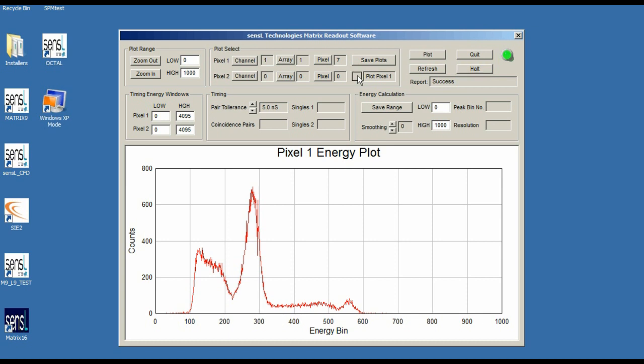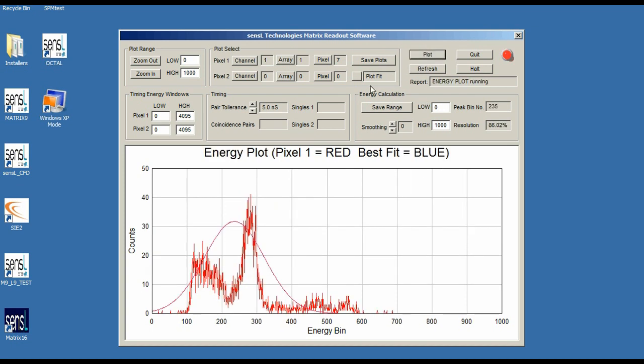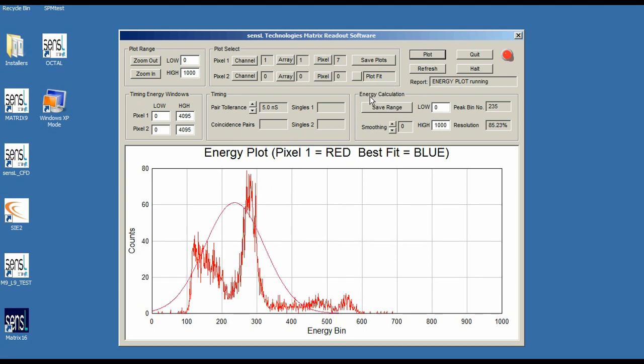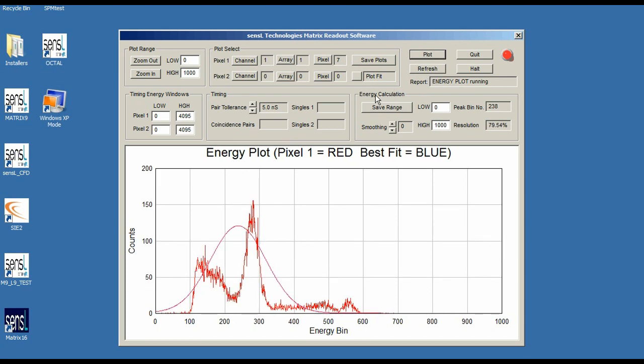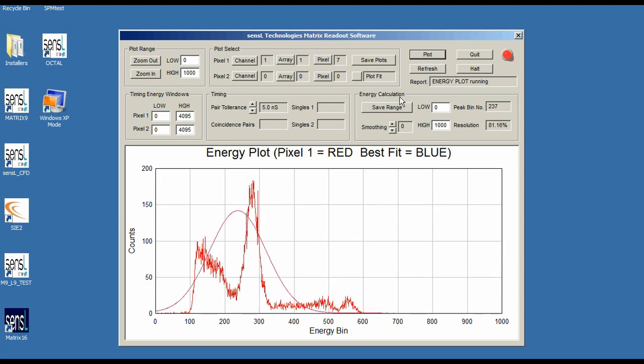I'm going to scroll through until I get to plot fit, and then I'm going to replot my graph. The plot fit button takes the energy calculation which is shown here on the screen and fits it.